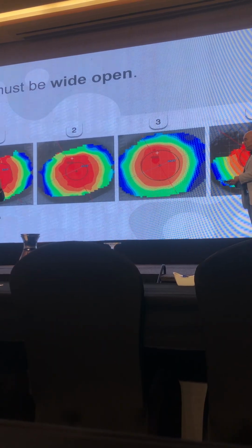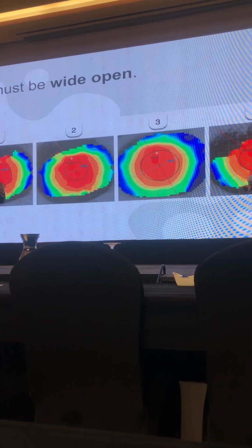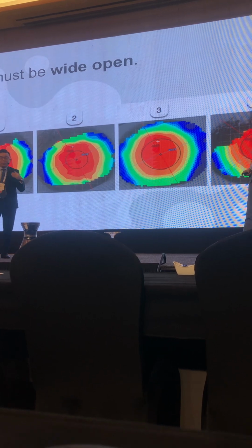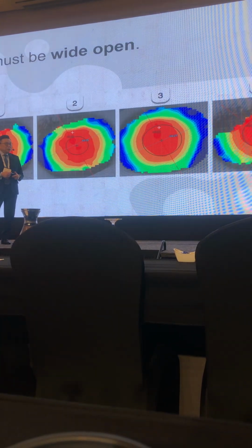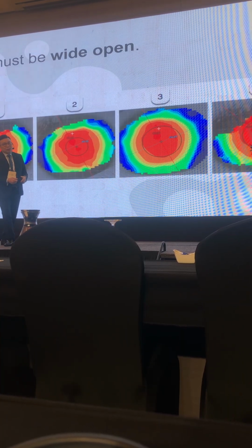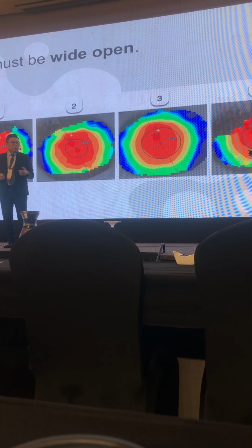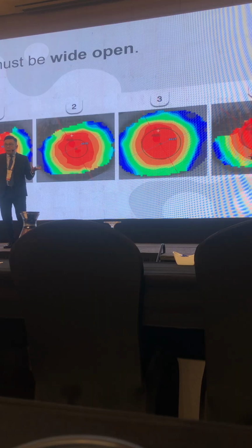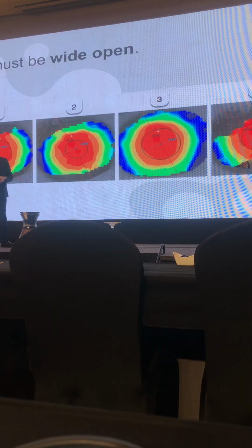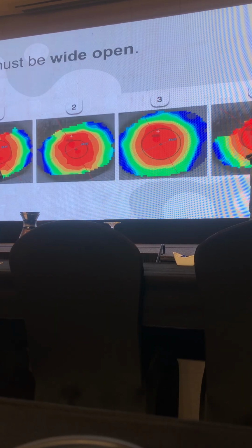He did studies on downward gazing changes of the cornea shape, and saw that downward gazing will change the inferior part of the cornea. So if we fit toric contact lenses, because nowadays we see more kids have toric issues, maybe from weather, maybe rubbing eyes, maybe too much electronic device use, try to settle this beforehand. Otherwise, we might measure something unnecessary, induce toricity to the cornea, and then affect how we order the lenses.